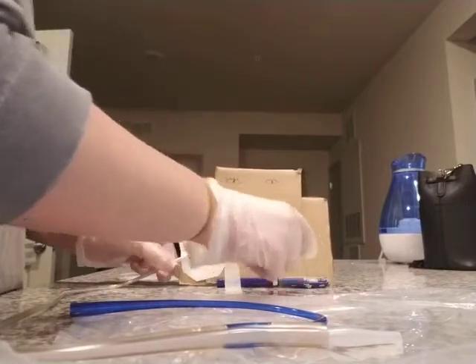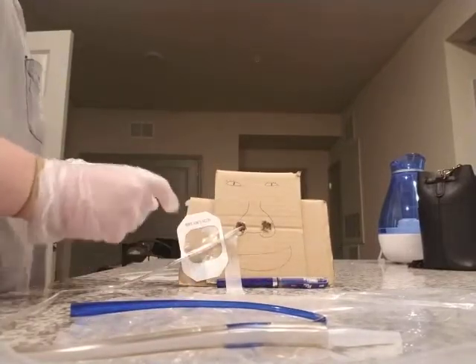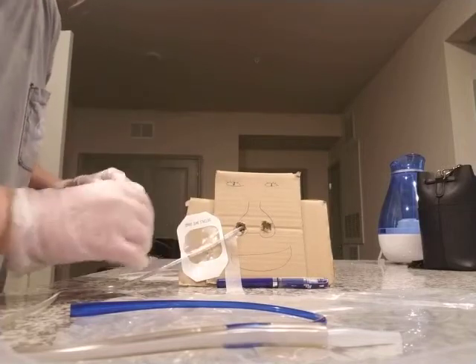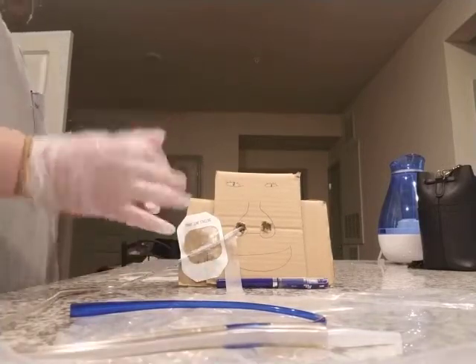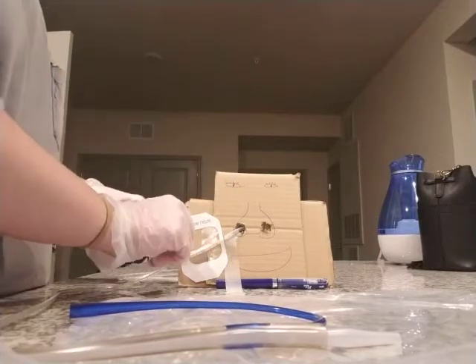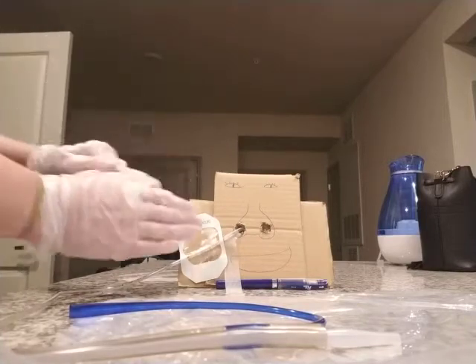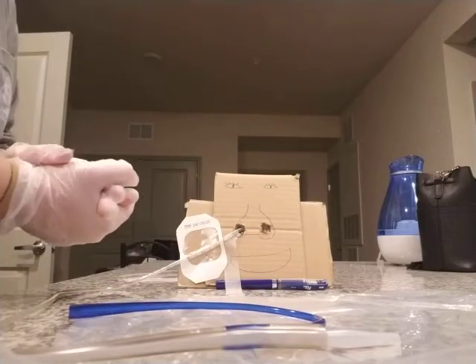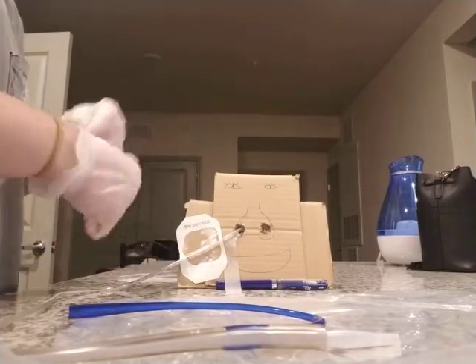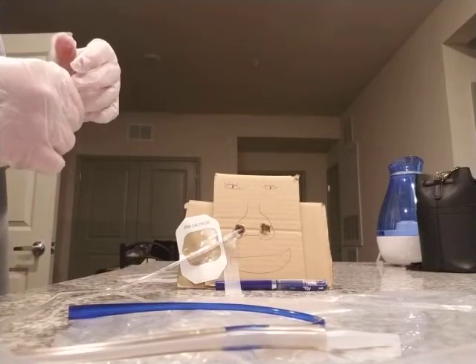I don't think Gladys can handle the stress of me taking off that white paper tape, but that would also be coming off. But you know, you gotta look out for the patient and not put them under unnecessary stress. So this is going to stay on Gladys, but in real life, that white part would be removed, and again, the edges would be carefully sealed.